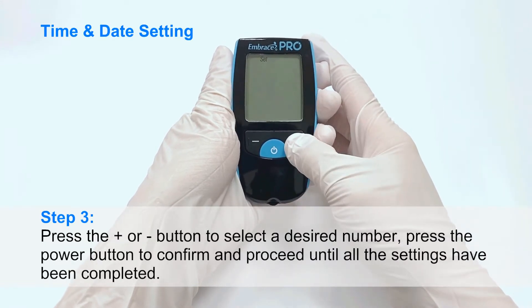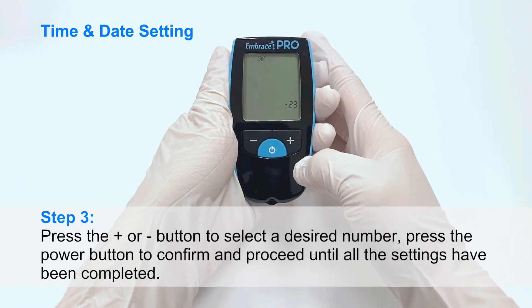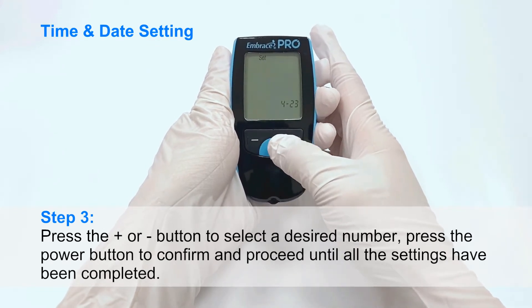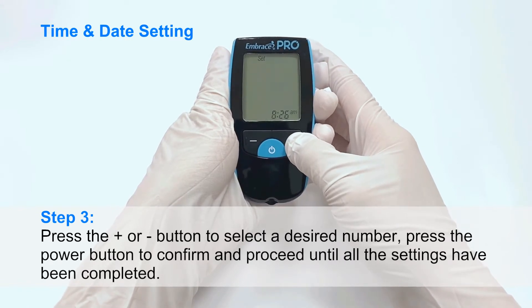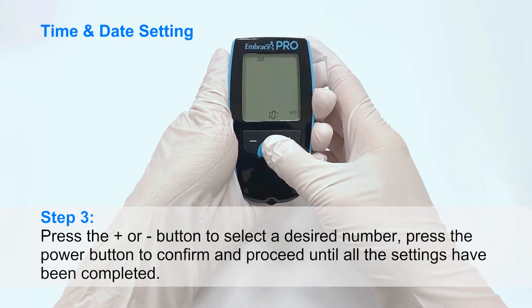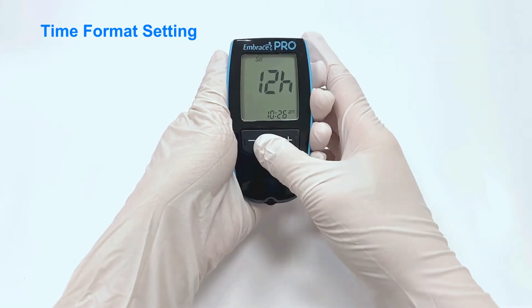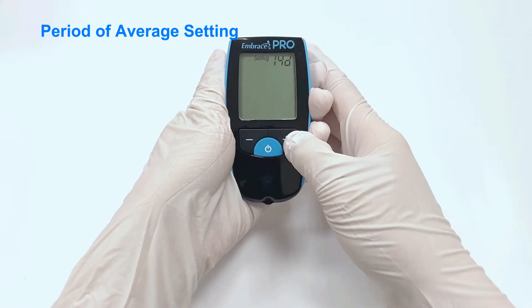Time and date setting. Step 3: Press the plus or minus button to select a desired number. Press the power button to confirm and proceed until all the settings have been completed. Settings include: time format, unit of measurement, period of average, and alarm.